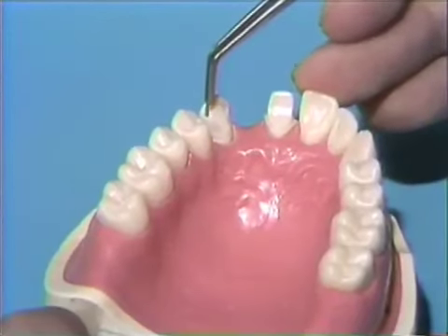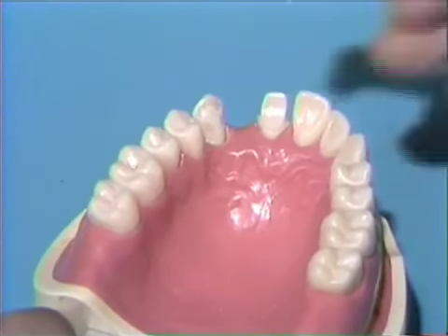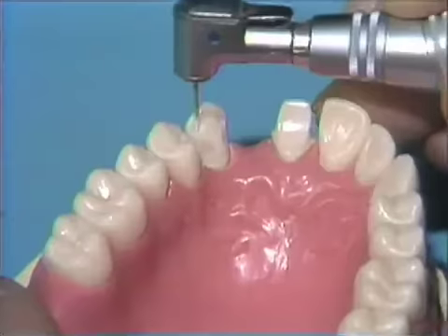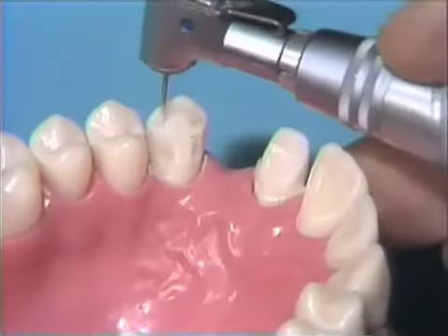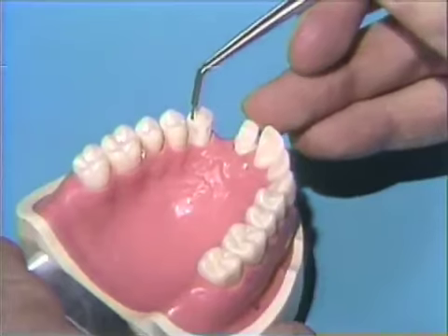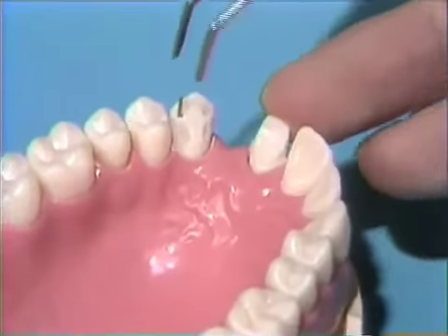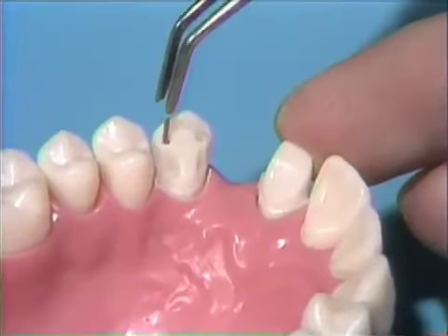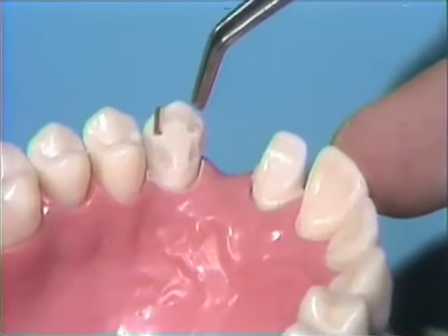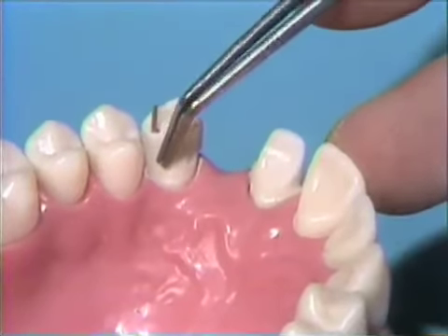So we'll take the impression pin out and go ahead and continue drilling the pinhole down to its two and a half millimeter depth. We're just completing drilling the pinhole to its depth. We're going to check our pin and place it in the pinhole. We've placed a little red wax on its tip to help stabilize it. It now lines up with the line of draw of the porcelain fused to metal preparation. We can leave this pin in and go ahead and drill the other two pinholes — one in the incisal at two and a half millimeters and the other at the cingulum at three millimeters.